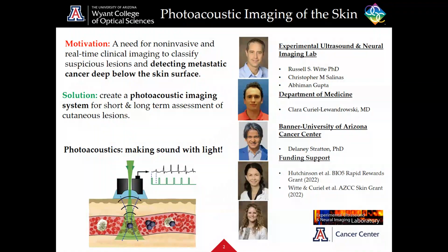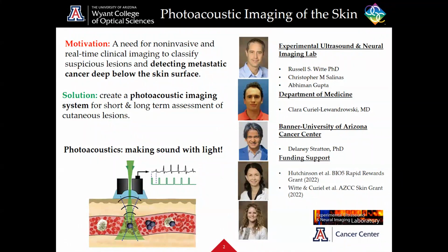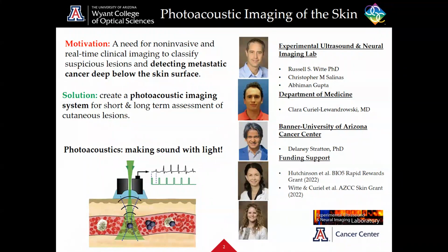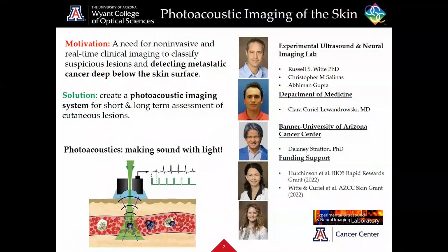And this is where our solution comes into play, which is using photoacoustic imaging, which is a type of ultrasound imaging, but instead of sending ultrasound into tissue and then measuring the reflected ultrasound like that's done in traditional ultrasound, what we can do is use light to generate sound. Typically, we send pulsed laser light into the tissue, which is absorbed, and then that generates ultrasound, and we can use that to create our images.